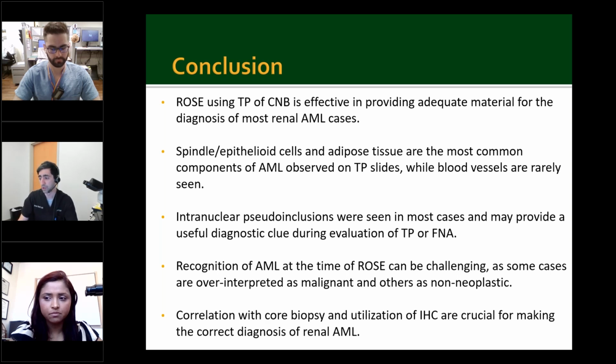However, this study also highlights the challenges associated with recognizing angiomyolipoma during ROSE procedures. Some cases may be prone to over-interpretation that leads to a potential misdiagnosis as either malignant or non-neoplastic lesions. Therefore, the authors emphasize the critical importance of these other ancillary studies.